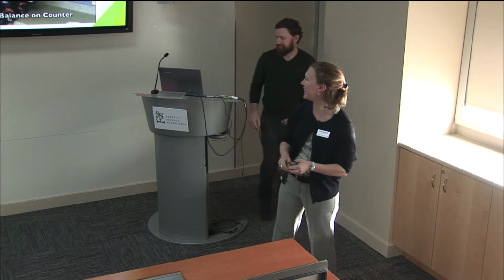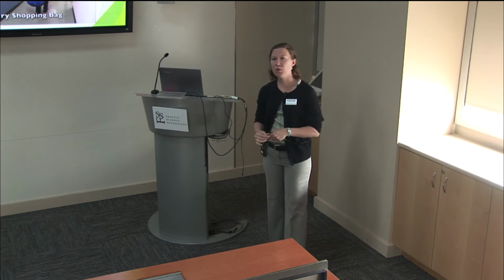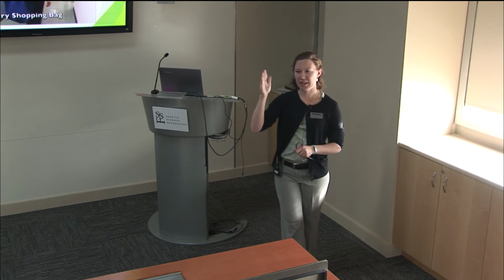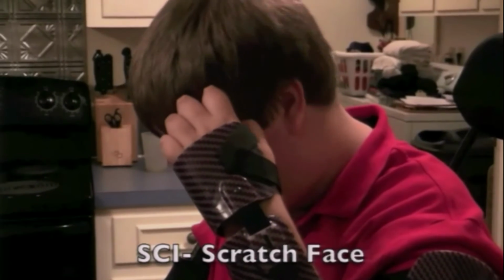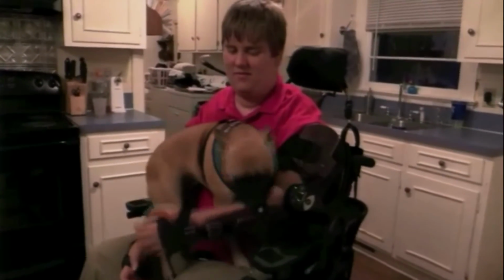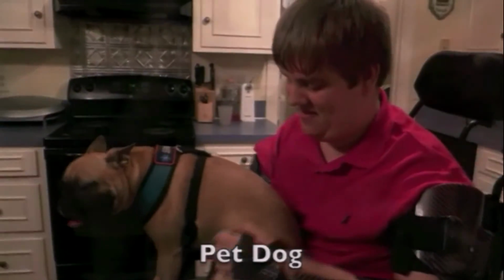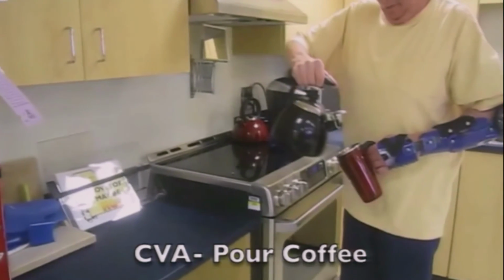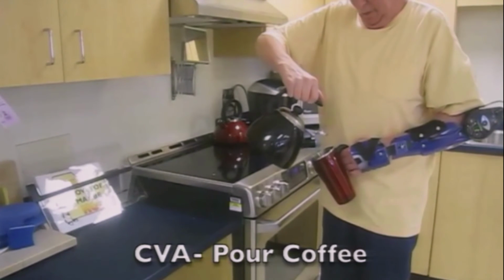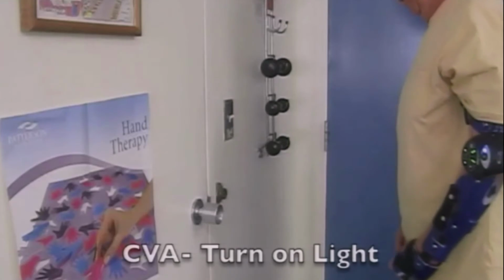Again, just some general tasks that patients are completing. You will notice this is an older video, so everyone does have just a static wrist. Their hand does not move at all. Because of that, some of these patients do have some of those terminal devices, like we talked about. There are some examples of harnessing in here. This gentleman here is a C5 partial, or incomplete, spinal cord injury. A lot of these patients do have low-tone strokes as well.